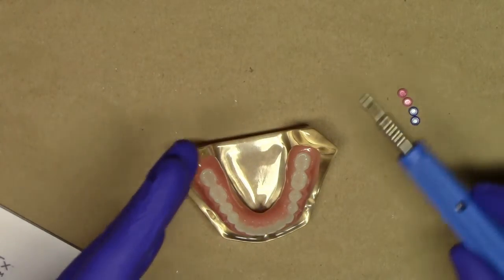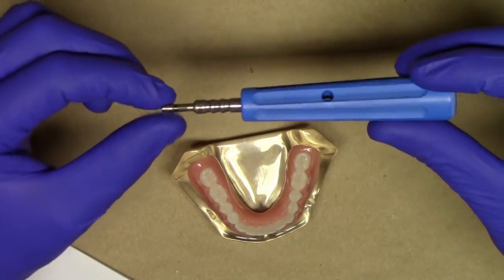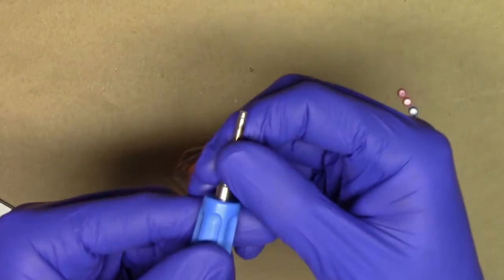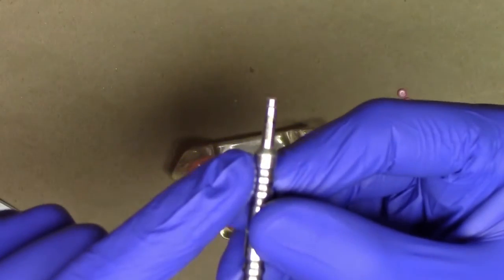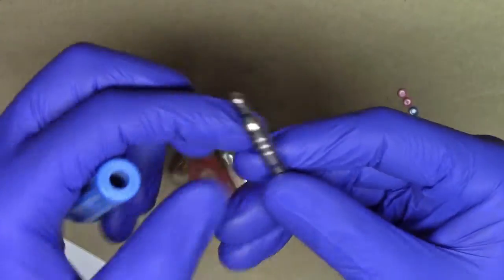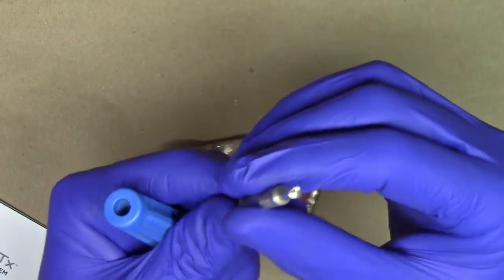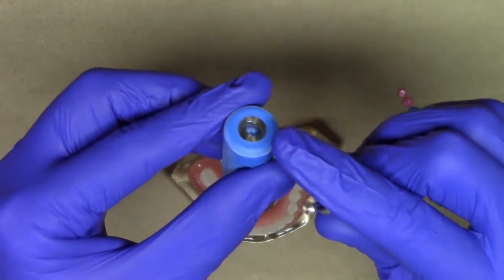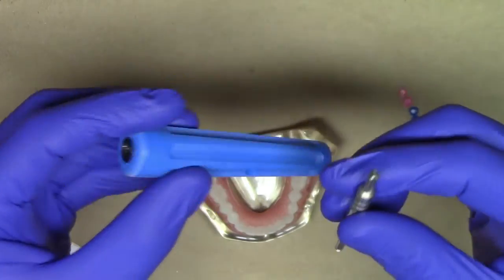I'm going to demonstrate removing the processing inserts. To do that, I have my retention insert tool. There's going to be a little area here as part of the silver tip of the tool — it's going to say 'in' with an up arrow and 'out' with a down arrow. The outside also has a flat portion of the tool, and there's a little metal structure on the outside part that helps you remove the insert after you've taken it from the denture.